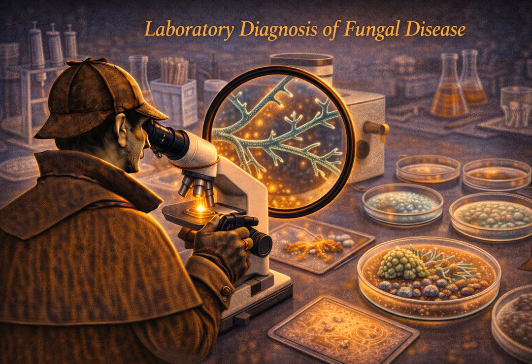Finally, just a brief word on molecular methods. PCR. We use PCR for literally everything else in micro: COVID, flu, MRSA. Why is it so tricky and less standard in clinical mycology? Primarily because fungal DNA is literally everywhere. If I ran a high-sensitivity, broad-range fungal PCR on the air in this recording studio right now, I'd find Aspergillus DNA. I'd find Pneumocystis DNA. The risk of environmental contamination and false positives from harmless colonizers is extremely high. We are getting better at targeted PCRs, but it's not nearly as plug-and-play as it is for viruses.